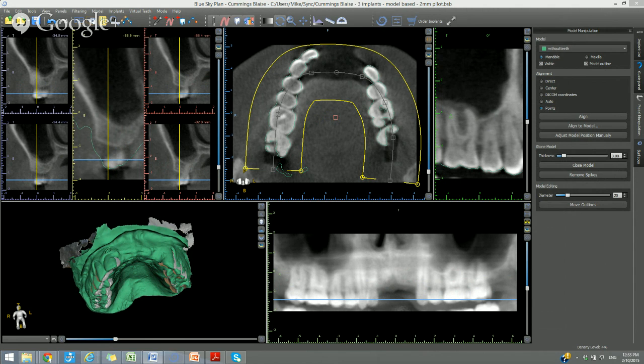Before wrapping up with information and support, we're going to do a little quick review. We discussed, just to summarize, the advantages of the model technique. The main advantage is that you could use non-FDA approved material, which makes the printer and the materials cheaper, much more affordable. If you want to put one in your office, it becomes much more of a reasonable and less costly option. Another advantage is you see the model, you see the post, everything is visually there.